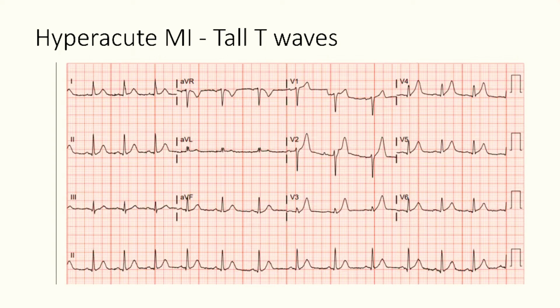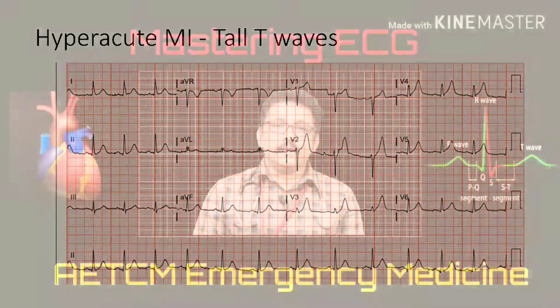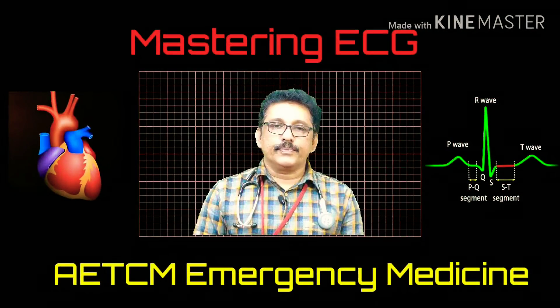In some area-specific leads, if you are getting tall T-waves, you have to think about hyperacute MI. In this ECG you can see tall T-waves in V1, V2, V3, V4, V5. If the patient is having chest pain, strongly think about anterior hyperacute myocardial infarction.